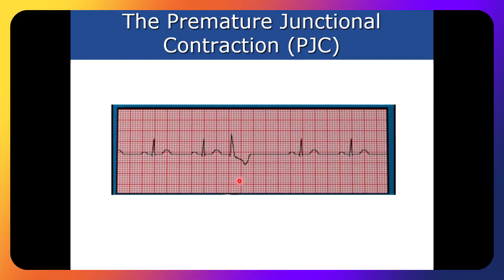Now, remember, we said that with PACs, you could potentially have a compensatory pause or not. Now, somebody remind me, compensatory pause means if it's there, why is it there?